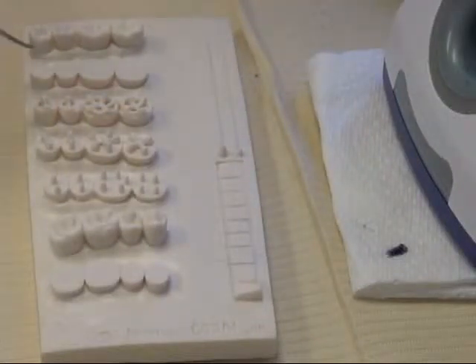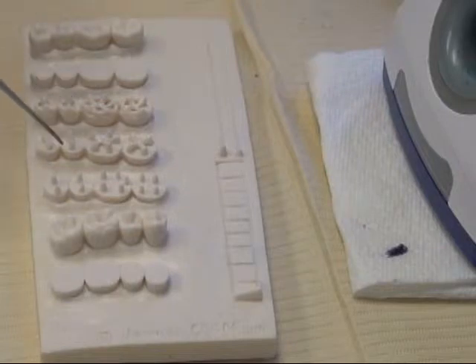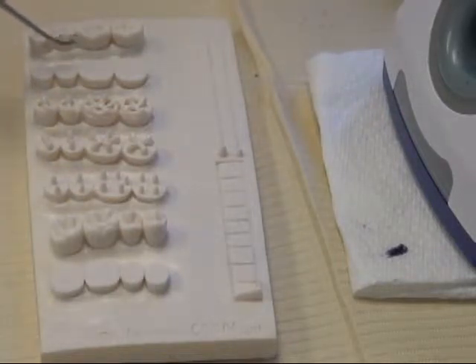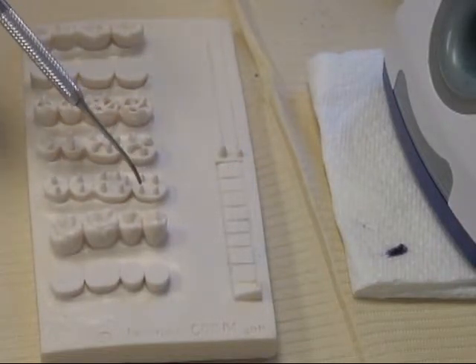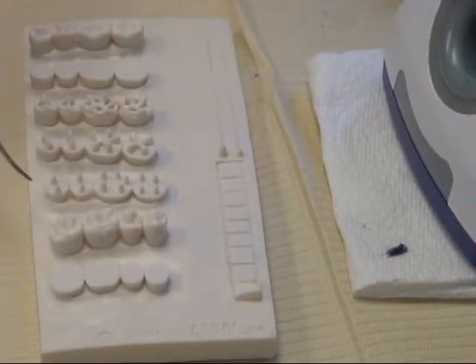This is what we call a drop wax block. It's a little device to show you the steps that one follows in waxing up a crown initially. We won't go into a lot of detail of the Peter K. Thomas method, but basically what you do is you place cones where you want your cusps of your teeth.